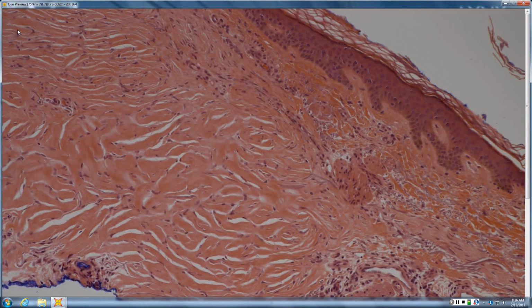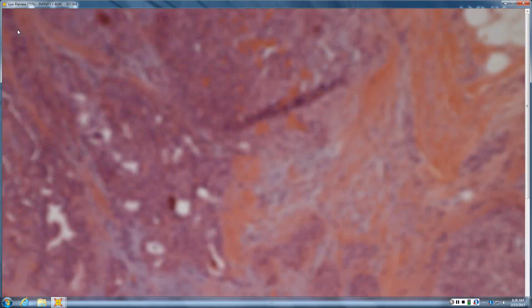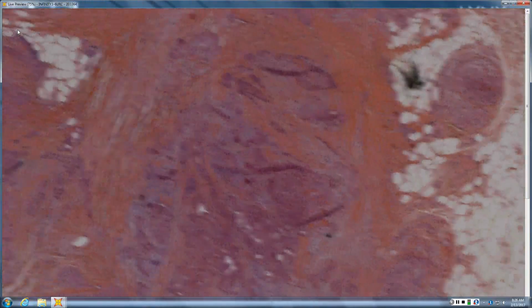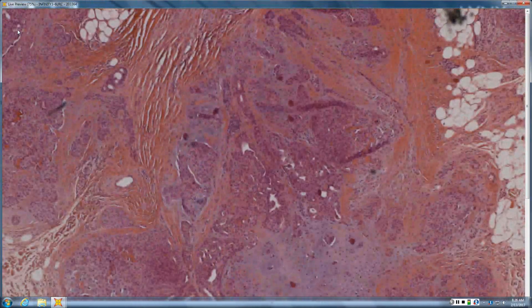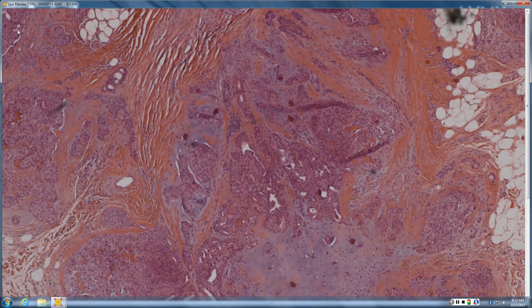Sclerotic fibroma, which can be a marker for Cowden syndrome, so it also gets called Cowden's fibroma. If you look at the sky in Starry Night, it's certainly a similar pattern. In fact, the rumors are that Van Gogh wanted to be a dermatopathologist, and he was trying to recreate a sclerotic fibroma. This is kind of like a mixed tumor. It has a branching alveolar pattern of ducts in some areas surrounding connective tissue, which can be fat, or the gray-blue of cartilage. So very good.